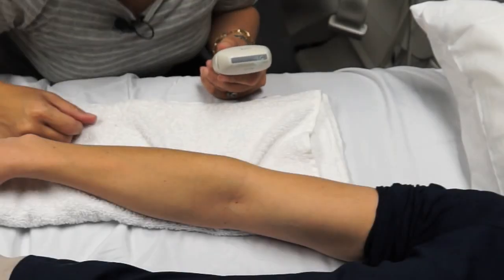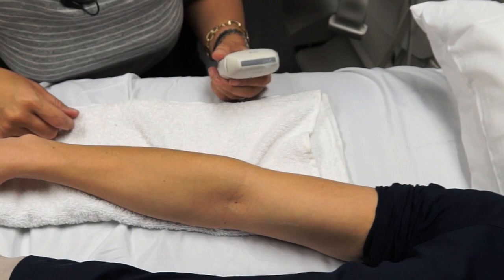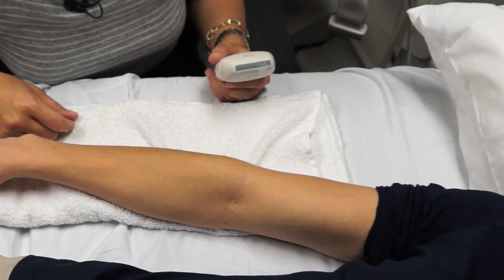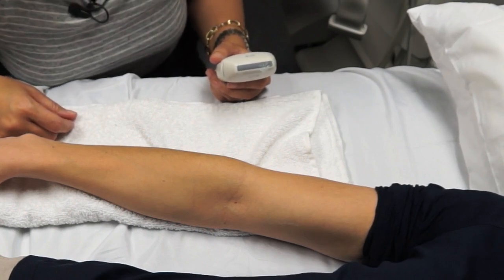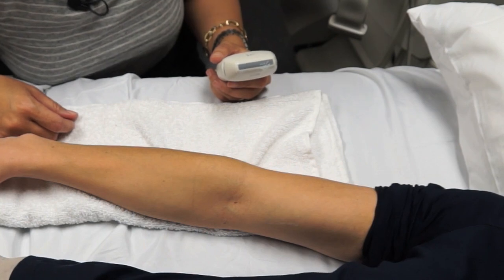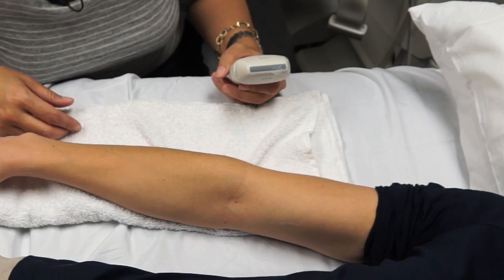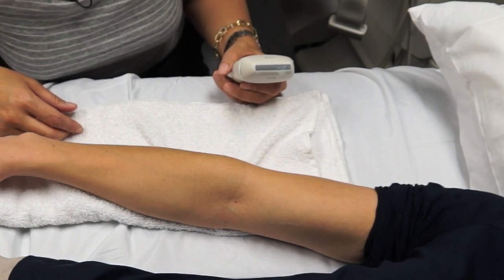Okay, when doing an elbow examination, we tend to divide it into 4 compartments. There's the anterior, the lateral, the medial, and the posterior elbow. And when you're starting out, it would be a good idea to scan all 4 compartments to get used to the scanning and to the anatomy, and later on you may target the examination depending on the presentation of your patient.